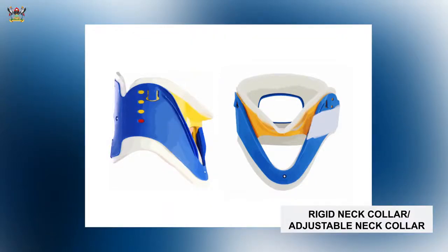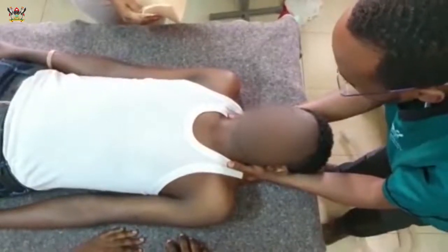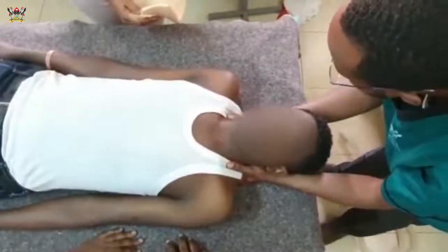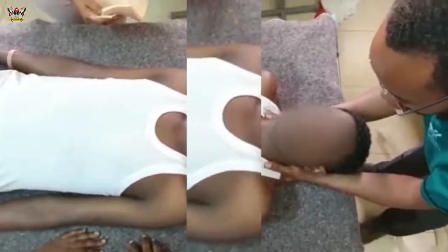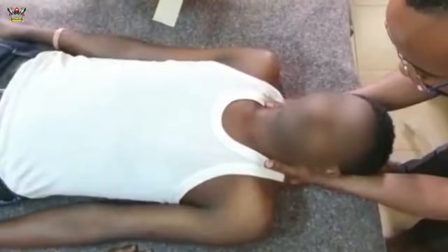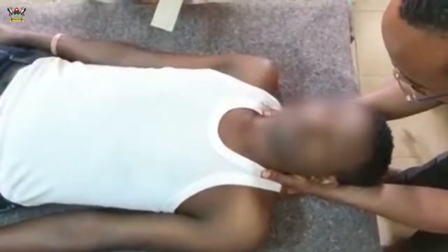In application of the semi-rigid neck collar, we separate the two pieces and slide the first piece below the head and the other on top, as we are going to demonstrate. At the count of three, I'm going to request my assistant to slide the neck collar below me. One, two, three, let's go.